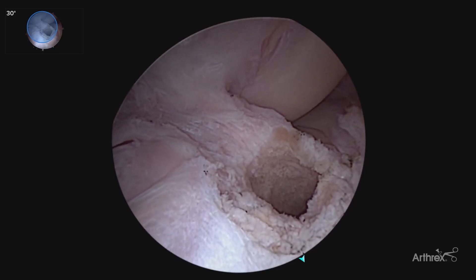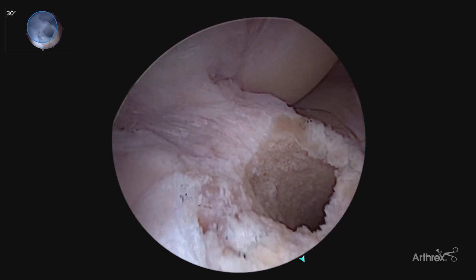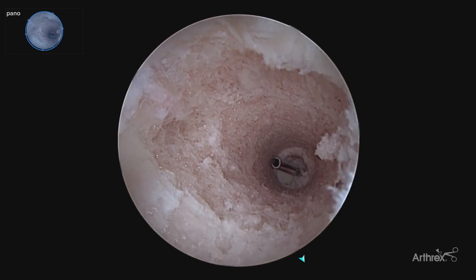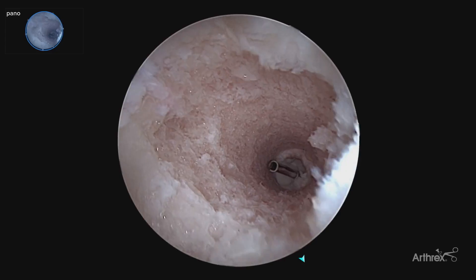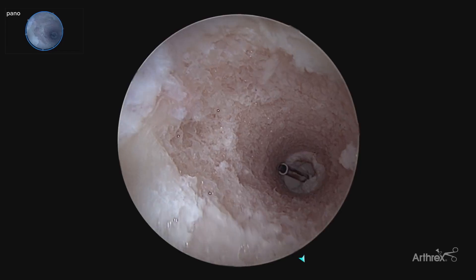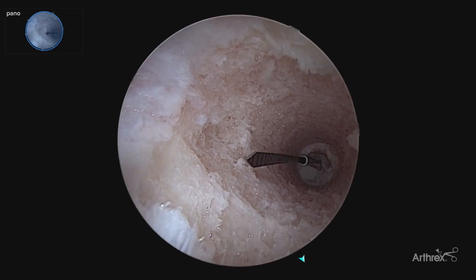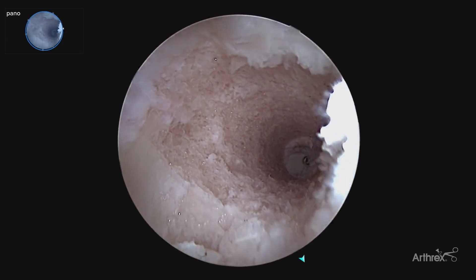Our tibial tunnel has been prepared with a 10-millimeter cylindrical reamer. Here is our typical 30 degree view where we can see the tunnel, and particularly the back wall. It's a little bit harder to see the anterior wall to see circumferentially. By switching to our panoscope, now we can visualize the tunnel circumferentially — a 360-degree view. This is important in ACL tunnel drilling if you're using an all-inside technique to get a sense of the depth of your tunnel. In a revision setting where you're looking for circumferential bleeding bone and removal of prior graft material, or assessing where cystic formation or tunnel widening may be, it also allows — in those circumstances utilizing a bone dowel or needing accurate assessment of tunnel depth — for us to visualize very accurately in all planes, circumferentially, the depth of your tunnel.